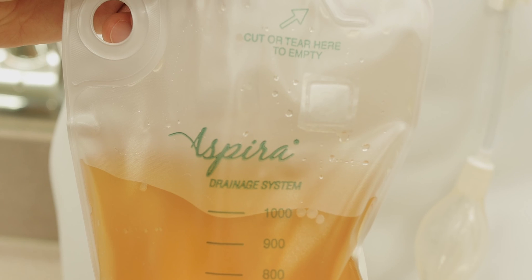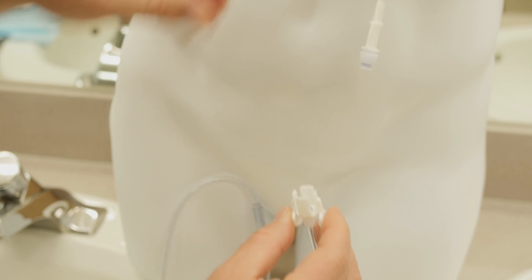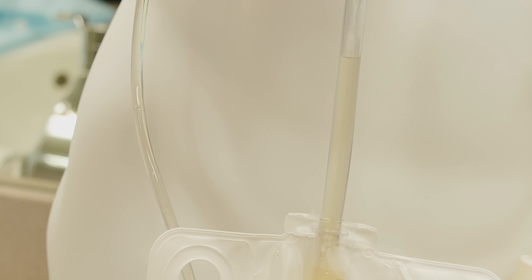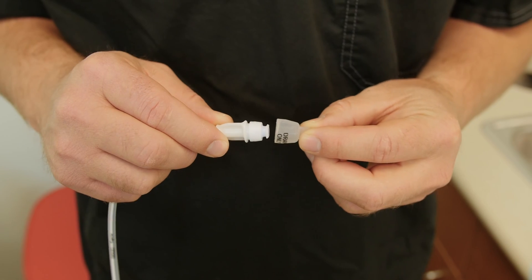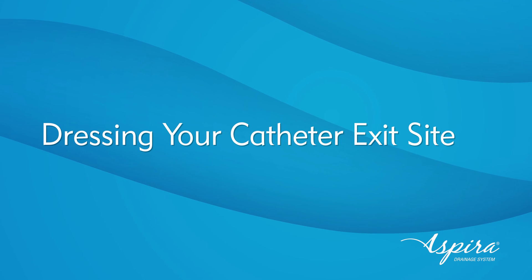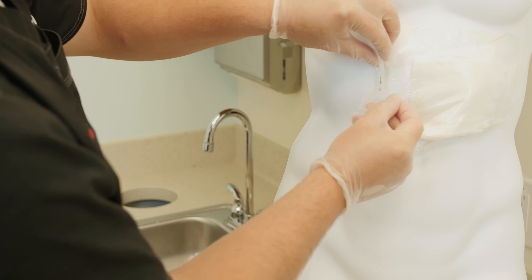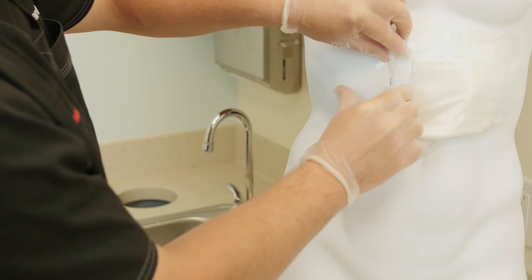When the fluid flow stops or the bag fills to 1000 milliliters, hold the catheter with one hand and pinch the wings of the connector with the other hand until the bag connector easily comes away from the catheter. Allow any fluid remaining in the tube to drain into the bag and set the bag to the side. Wipe the catheter valve with a new alcohol pad. Place the new valve cap over the top of the catheter valve. If it is not time to change the dressing, tape the catheter to the skin where it is most comfortable for you.